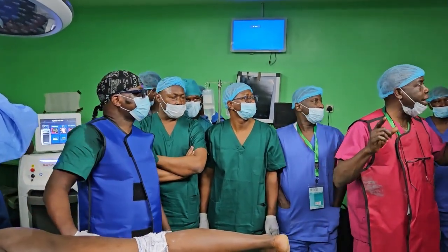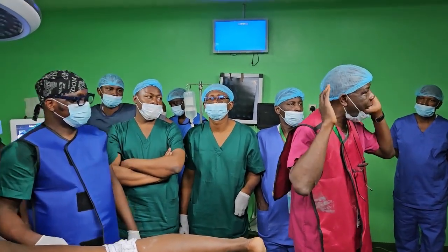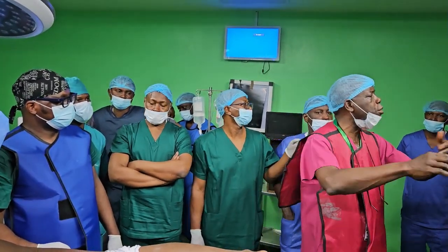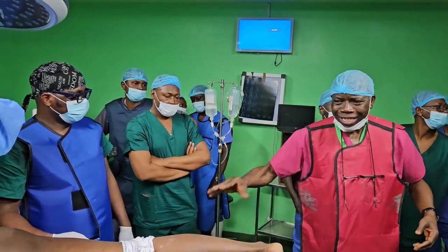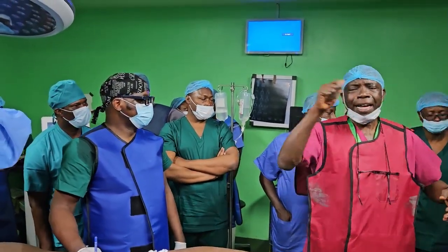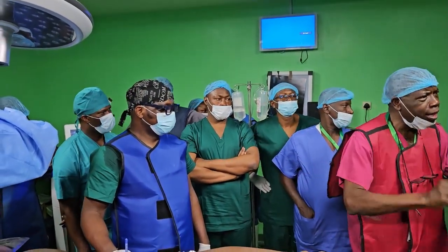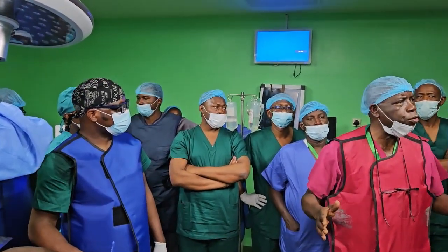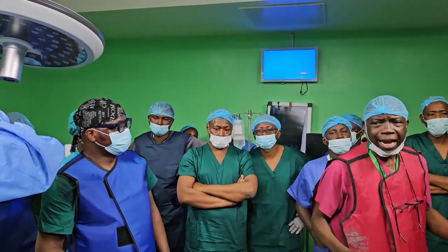Quick point. Anybody that is preparing for a C-arm, please troubleshoot before you start preparing cases. You have to do a dry run. Remember what happened in Jabi? You must look at your system, make sure everything is working. Before you start putting cases together, get your radiographer, tell them to make all these movements, speak to them. So when you start the procedure, it's one step to the other. They are basic steps, all right? Very important. You don't want to do your full setup and then find your table will not go up, or you can't put your patient on the table properly. Alabi, please go ahead.